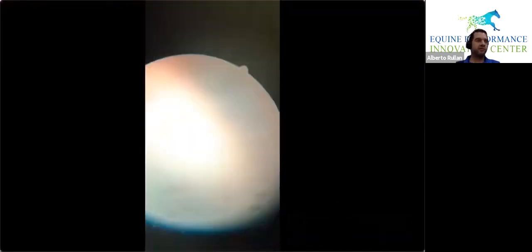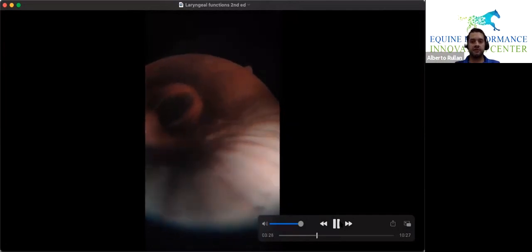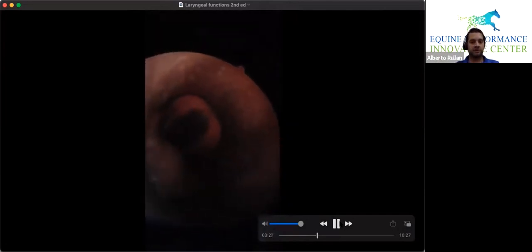And this is real time. So this is what you're going to see when you're in the scope. You're going to see a lot of mucus. Sometimes in the books they present you beautiful pictures, but that's not always the case. Sometimes you have a second or 2 seconds just to look at these scopes.